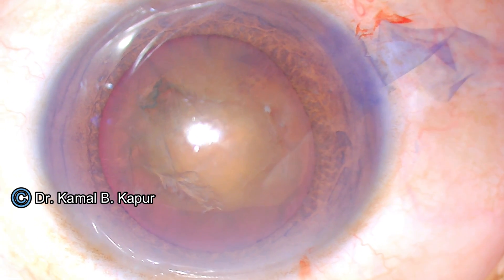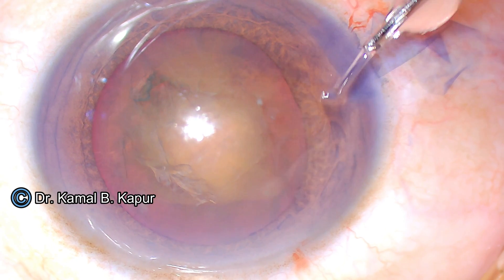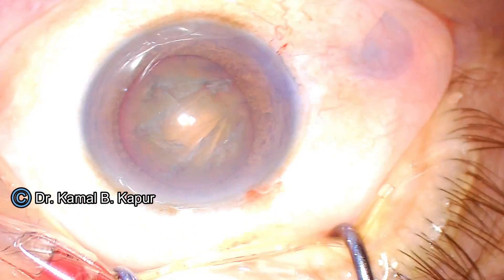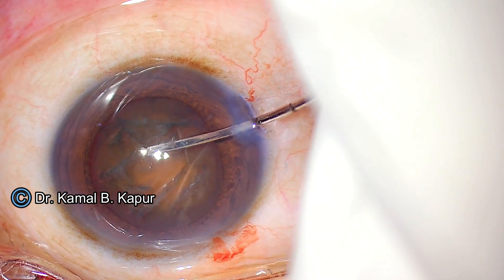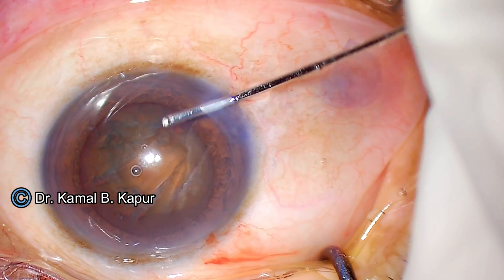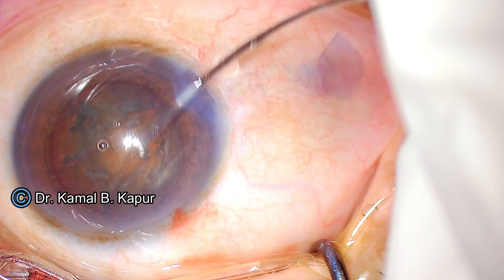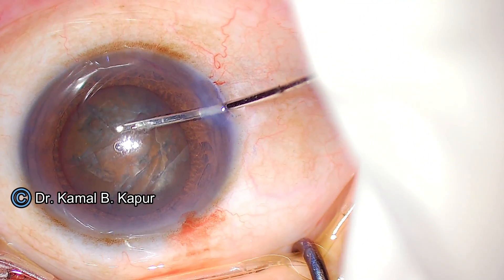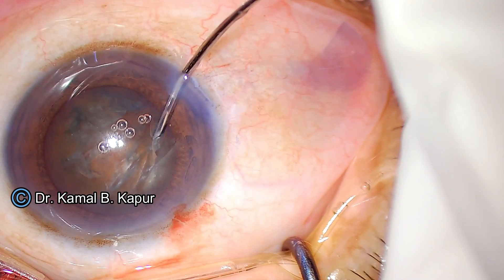We now proceed to use a special cannula designed by me — a curved, smooth, round, blunt-edged 23-gauge cannula. We perform hydro-delineation and avoid hydro-dissection, making sure there is not much pressure fluctuation and no pressure on the cataract toward the posterior pole, as this can result in the posterior capsule opening.